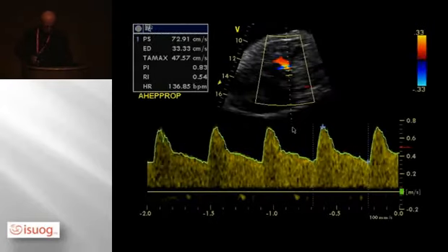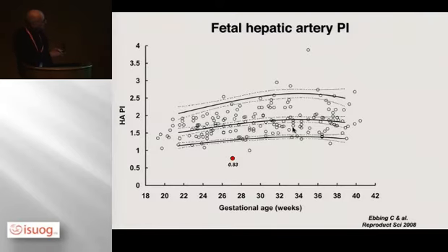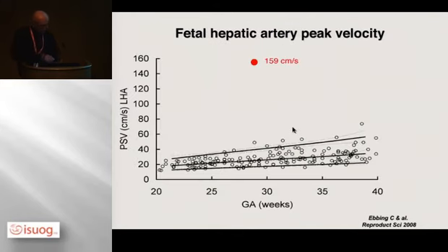It is flowing. In this case, enormous velocities. And if you plot it on the normal ranges, you see the pulsatility is down here, and the absolute velocity is up here at the most. The reason for this is there is something called adenosine, which is vasodilating. Adenosine is produced in the liver sinusoids continuously. The portal system washes this adenosine out. At the moment when you have less portal perfusion, the adenosine concentration increases and it dilates the arteries. That's what you see.